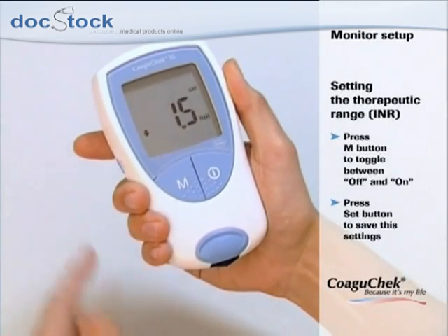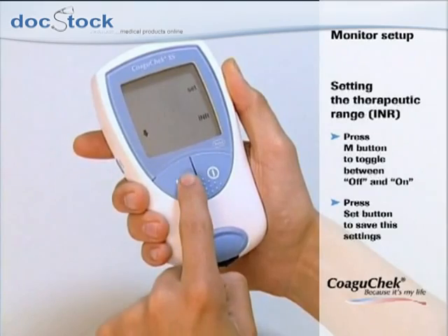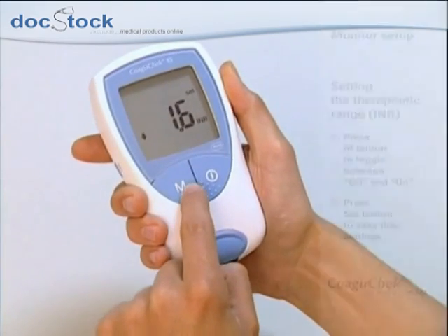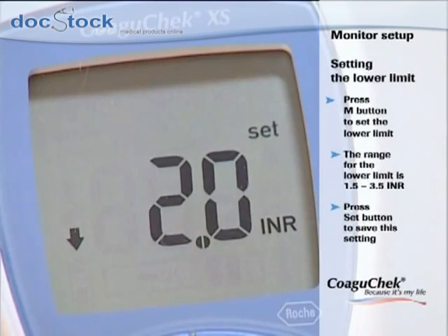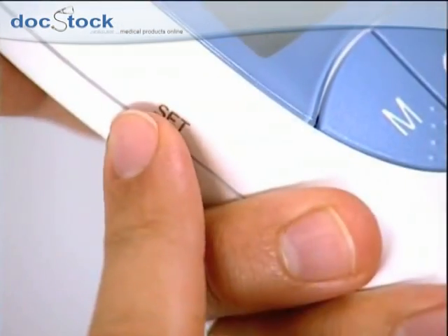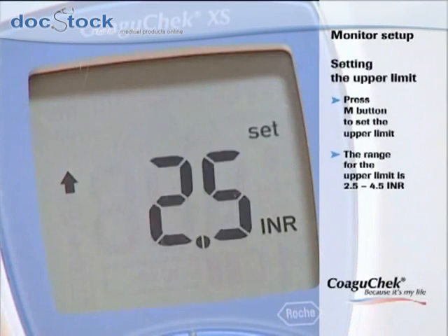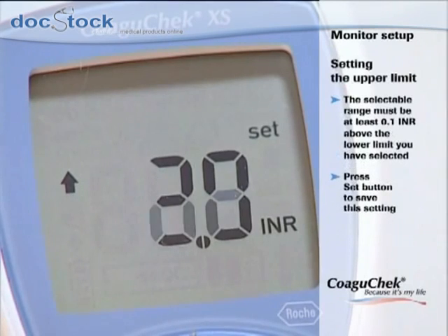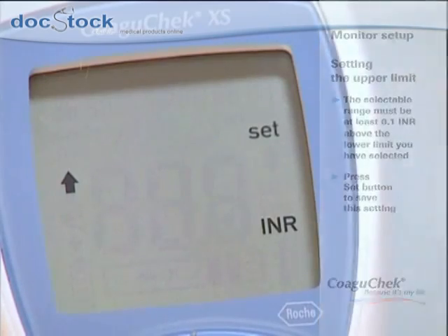If you have decided to use this function, you are now able to enter the limits of your target range. Consult your doctor about which target range is appropriate for you. Press the M button to set the lower limit within the range 1.5 to 3.5 INR, then press the set button to confirm. Now press the M button to set the upper limit within the range 2.5 to 4.5 INR — the desired value must be at least 0.1 INR above the lower limit. Press the set button to confirm.